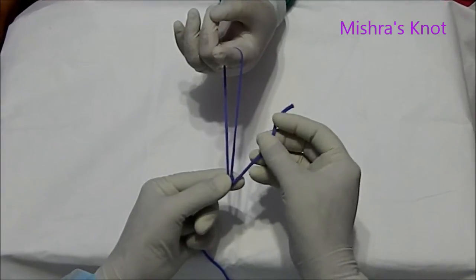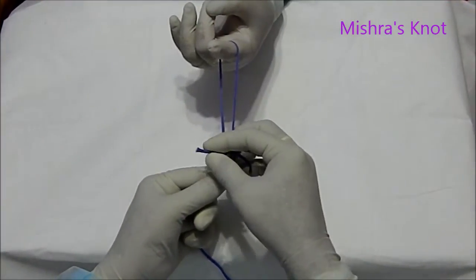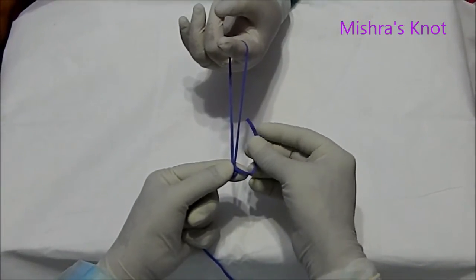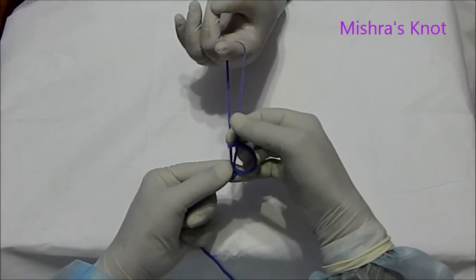Then the third wind will be taken. And after the third wind, this is the third half knot. That is the last knot.